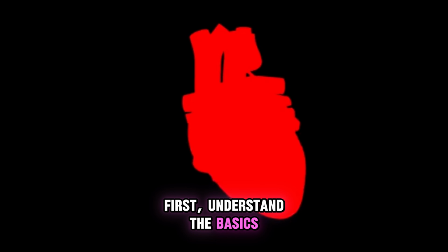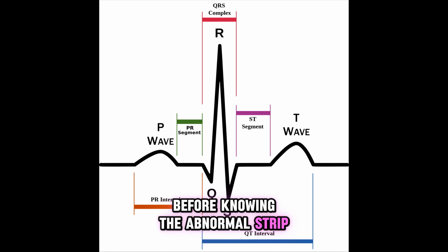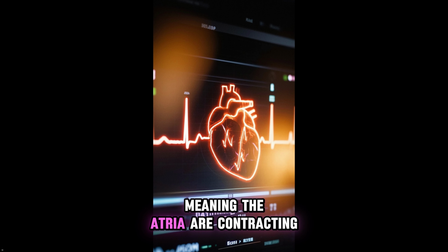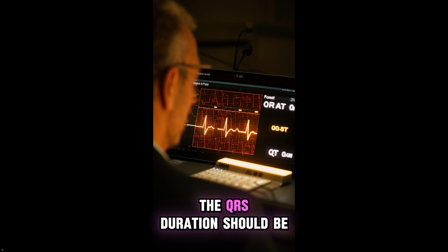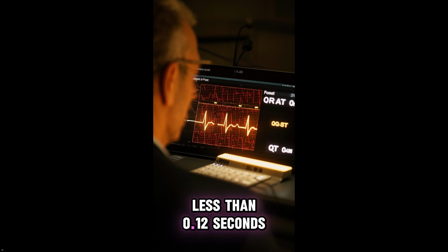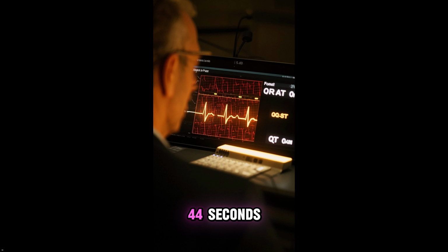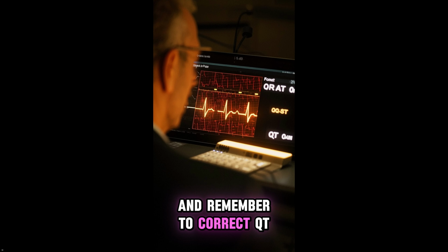First, understand the basics. Before knowing the abnormal strip, we must know the normal ECG strip or graph. The P wave represents atrial depolarization, meaning the atria are contracting. The QRS duration should be less than 0.12 seconds, and the QT interval should be less than 0.44 seconds. And remember to correct QT for heart rate.